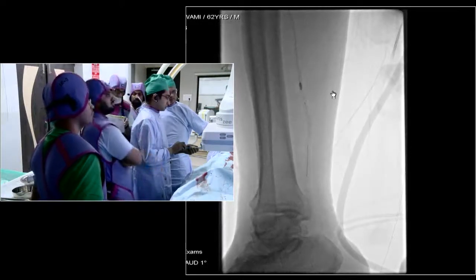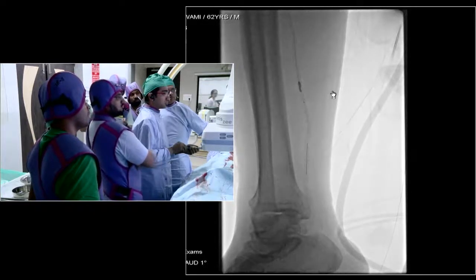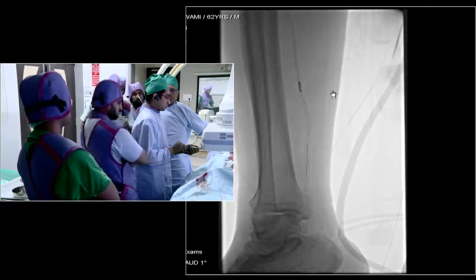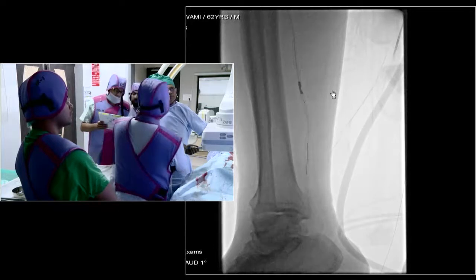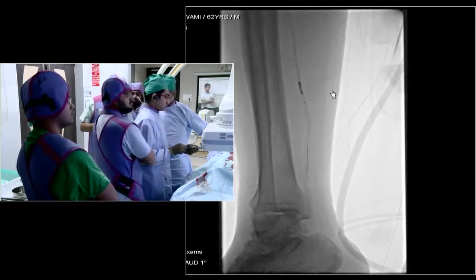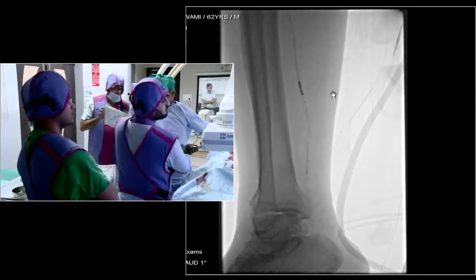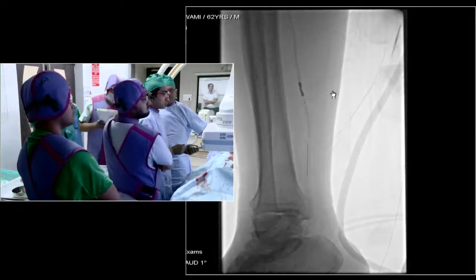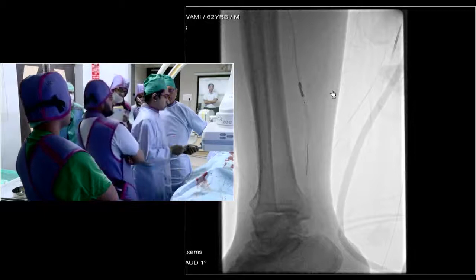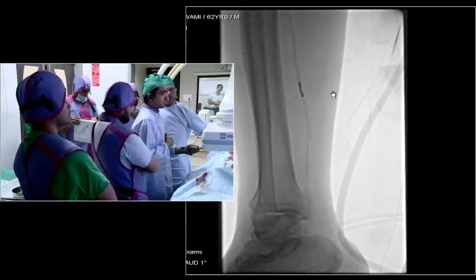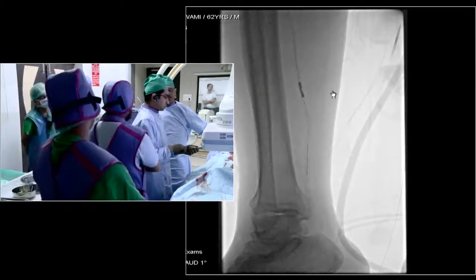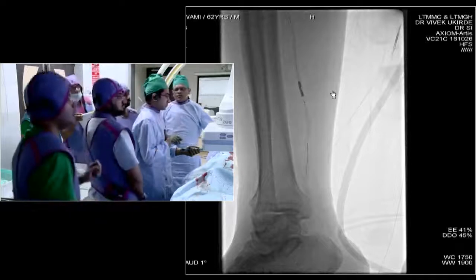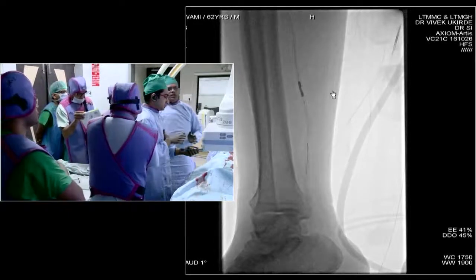This has to be done very gradually. We are counting 10 seconds after each atmosphere and we are at seven now. Is this special for the scaffold? Yes — initially we go to four atmospheres and then after each atmosphere we wait for 10 seconds before inflating again. We have reached nine, which is nominal, and will wait for one minute. There is a little waist seen, for which I will be doing a post-plasty at higher pressure.